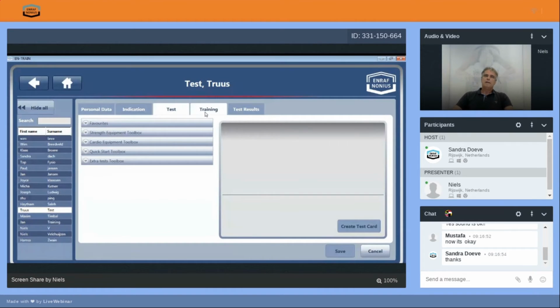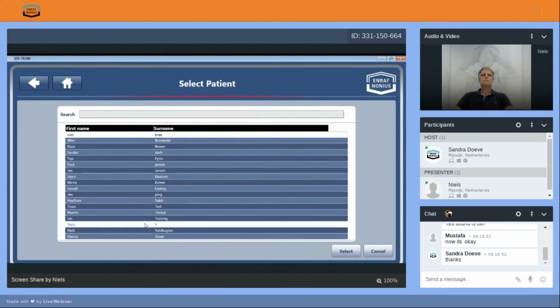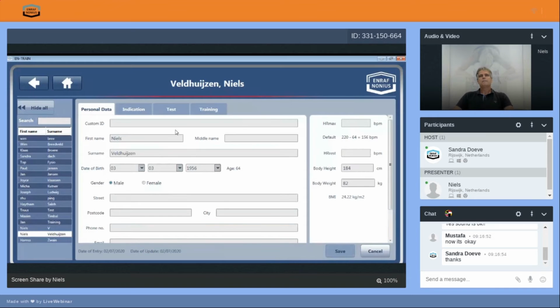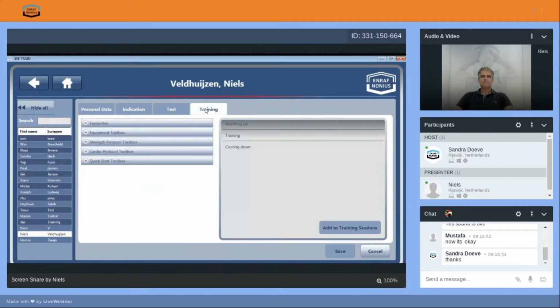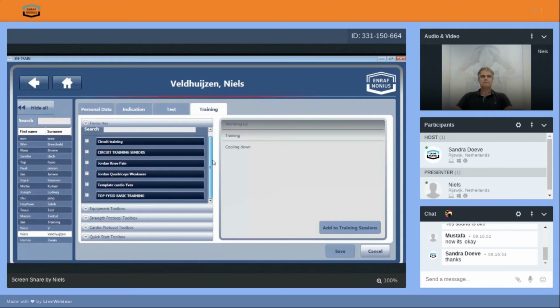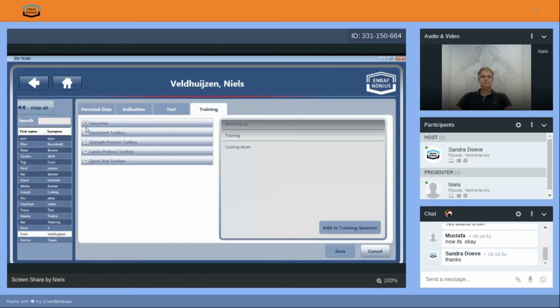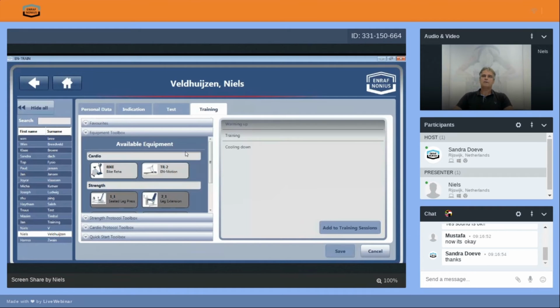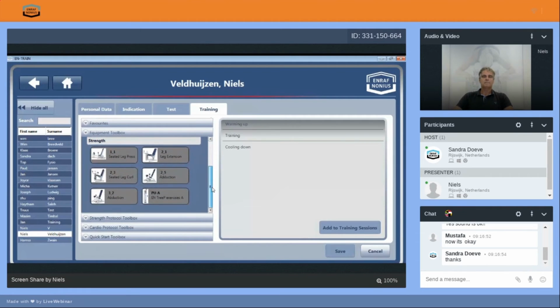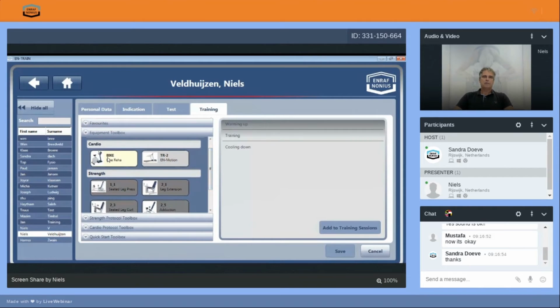Now, if we get back to Niels, where is Niels? There is Niels, yeah. So we've done a test, then we go to training. So here we can create a training for Niels. We can, of course, the simple way, the fast way, pick one from the favorites. Can be anything, of course. Or you can make one yourself. Let's say go to the equipment toolbox, then you see the available equipment in your clinic. These are available in your clinic. So we say, okay, we want to have Niels on the bike.